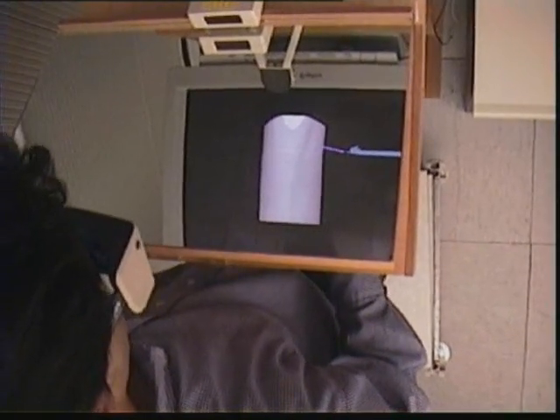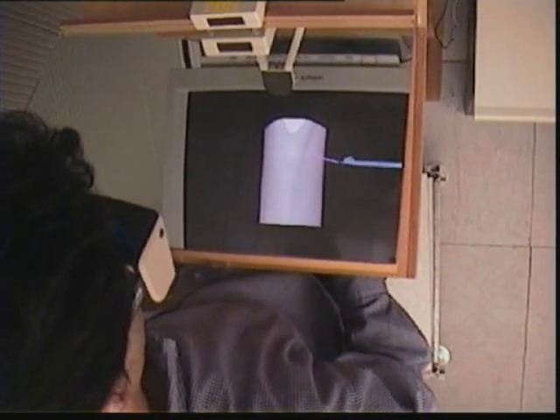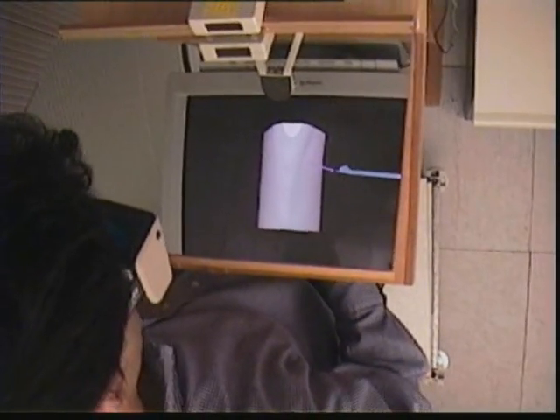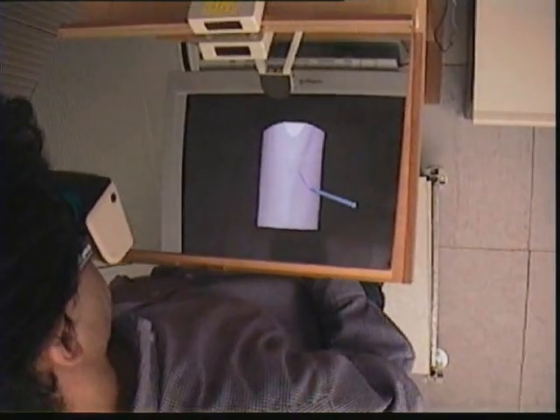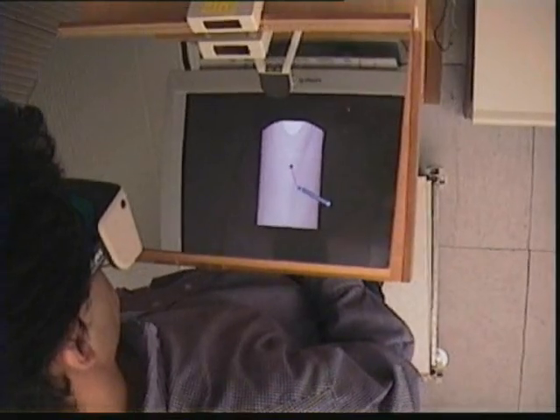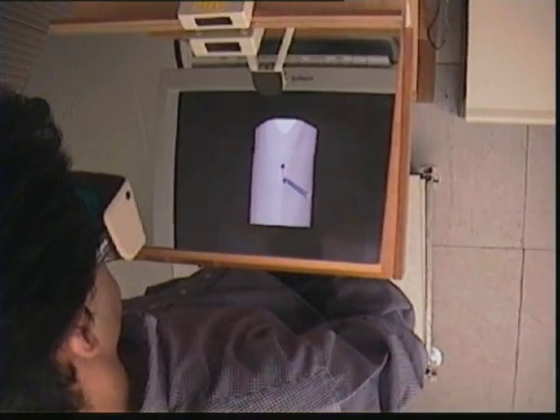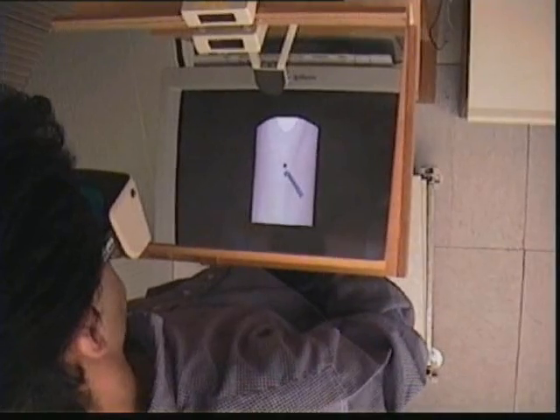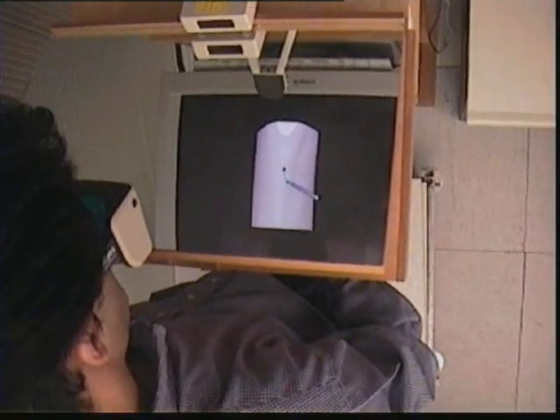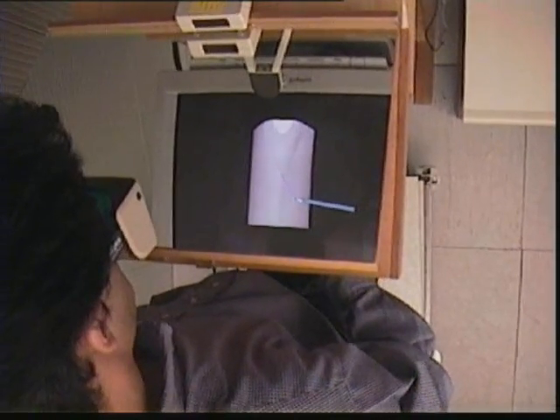Our system makes it possible to train surgeons on actual patient data, providing combined visual and haptic feedback. We are currently extending it to the simulation of other types of operations.